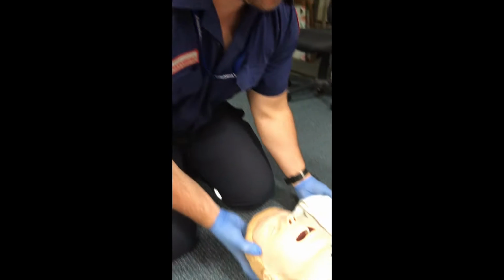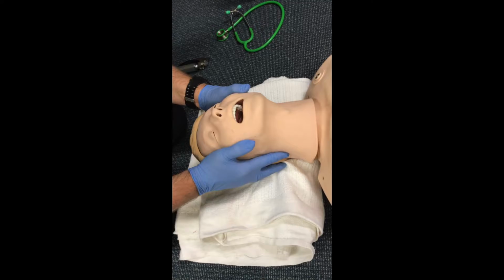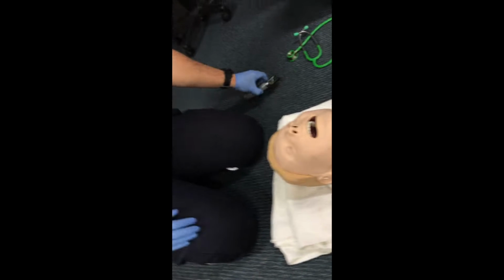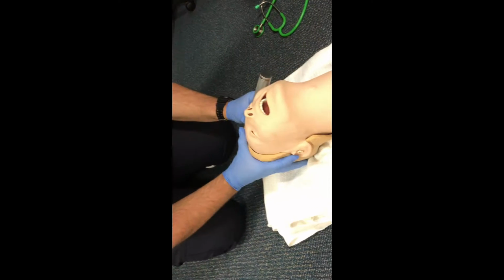To perform laryngoscopy, you need to put the patient's head into the optimum position. This is the sniffing position, which can be assisted by placing a towel underneath the patient's head. Grab your laryngoscope with the correct size Mac blade, ensuring that the bulb works and is bright. Place the blade to the far right corner of the mouth, advance in and sweep the tongue to the left as you advance the handle.